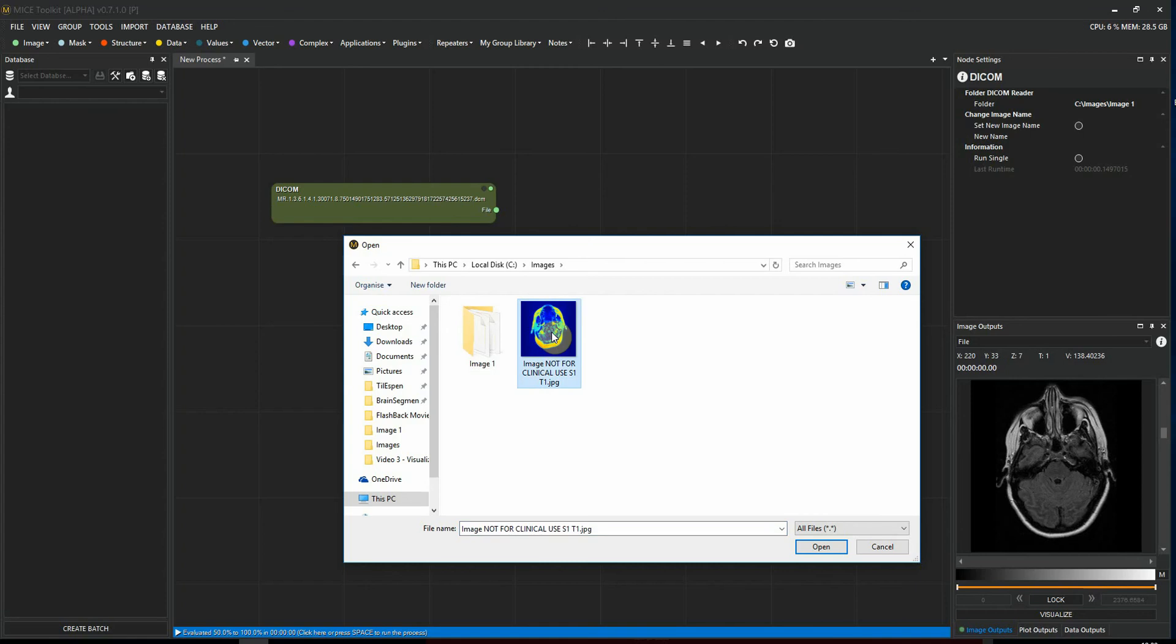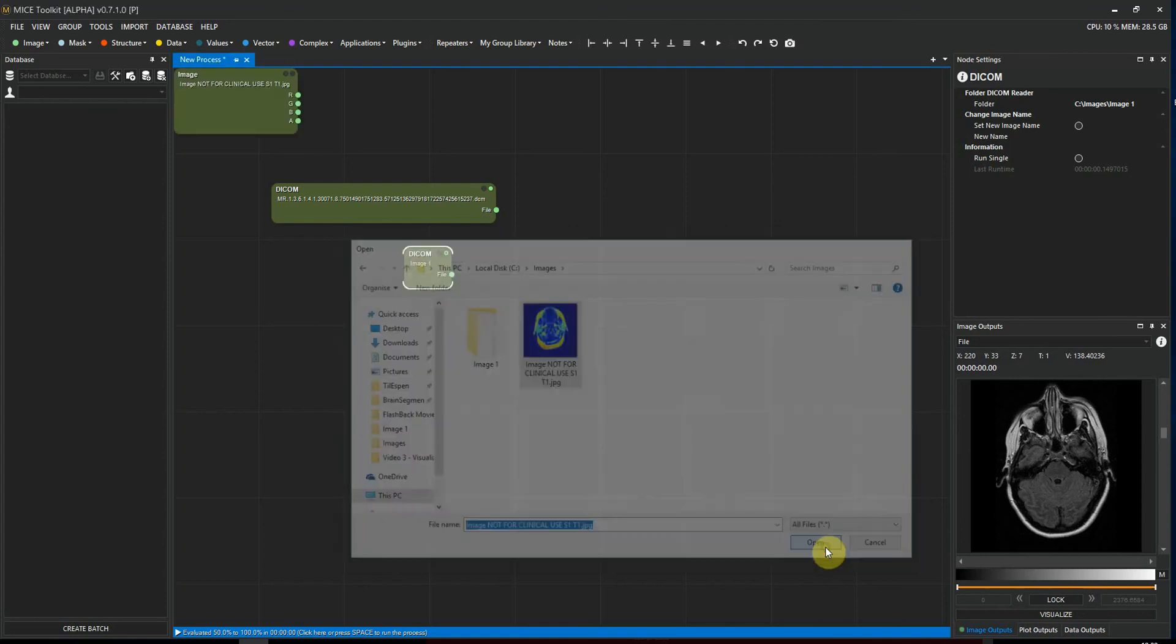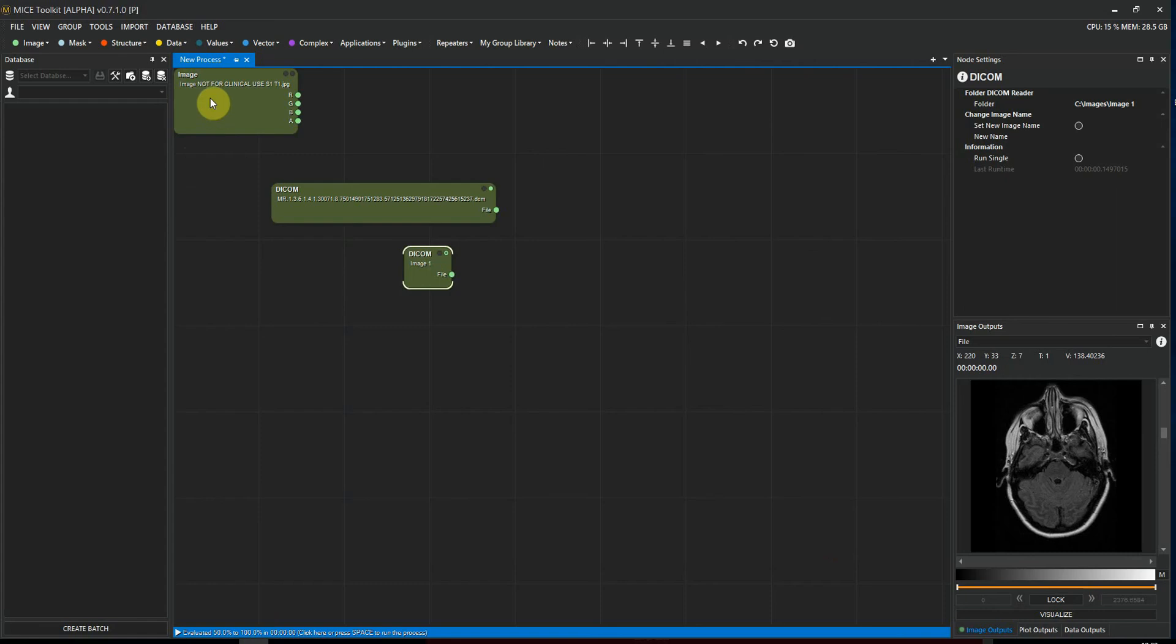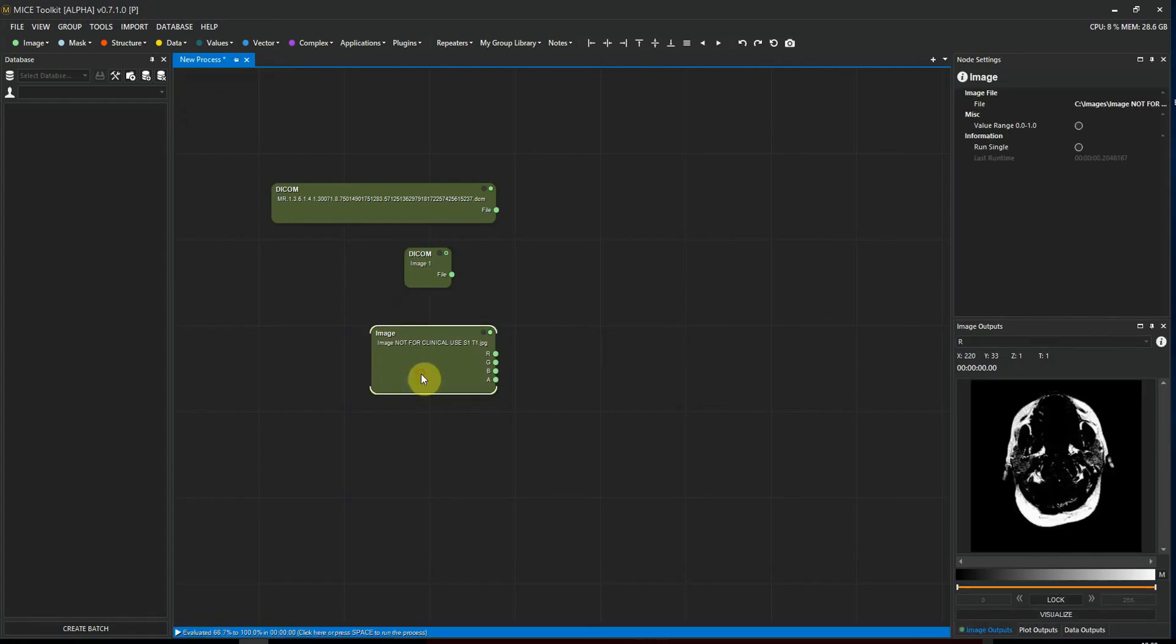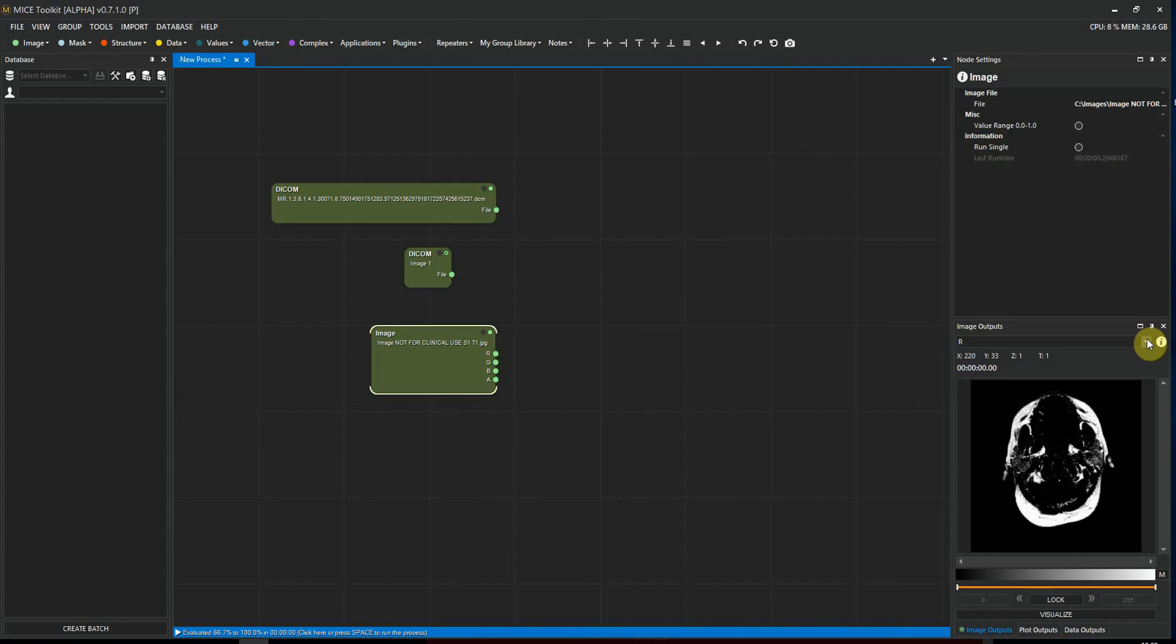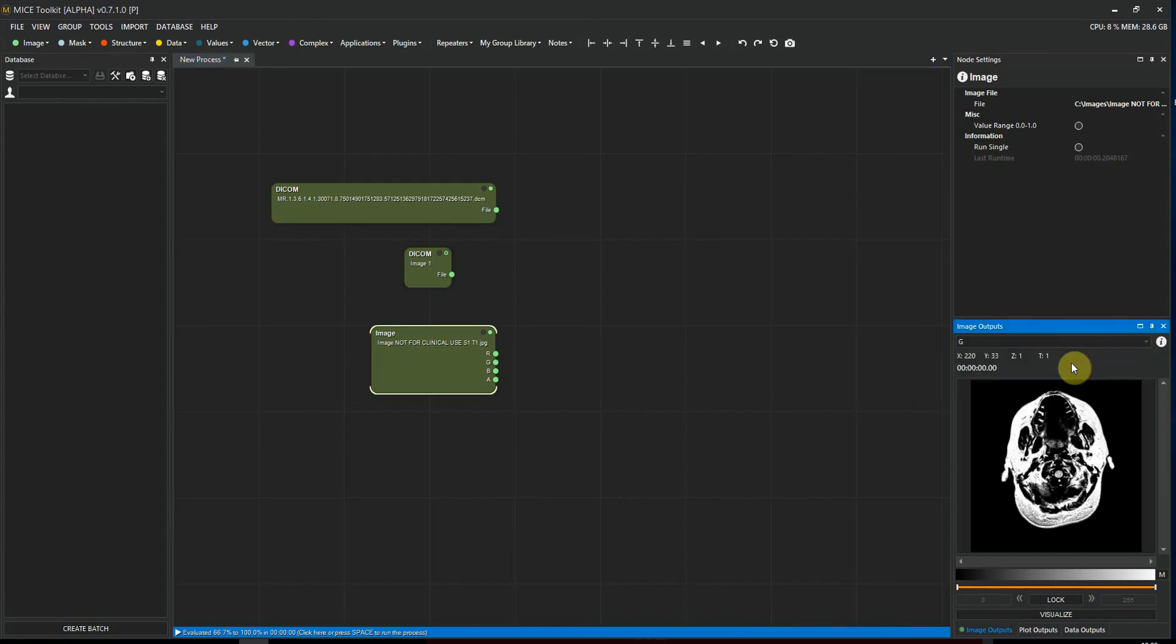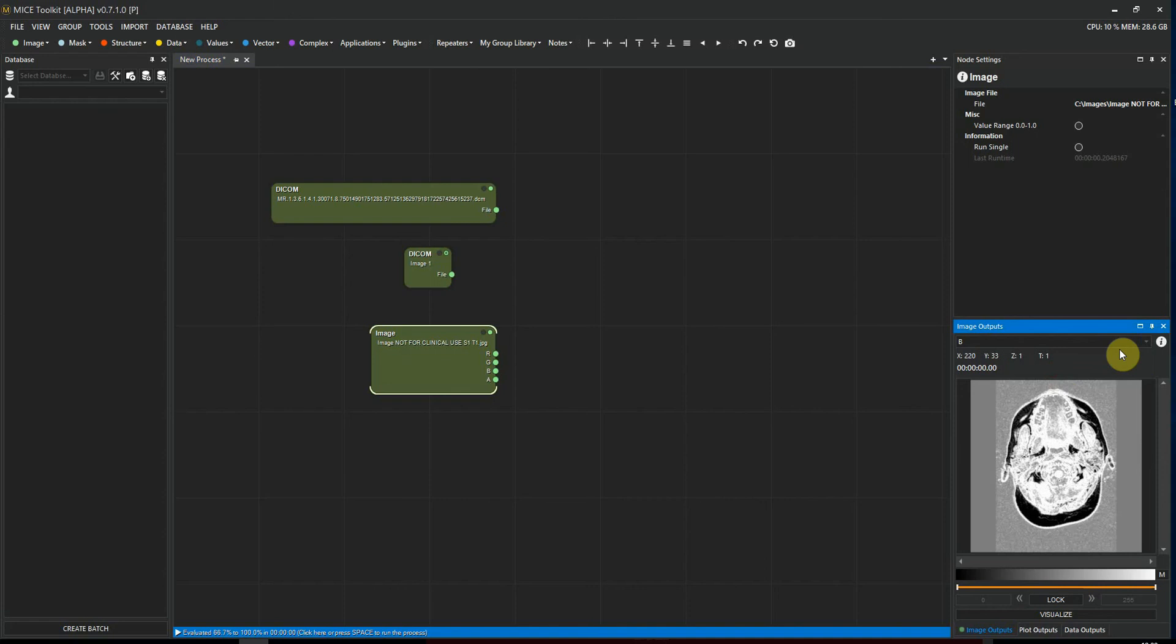I press spacebar to execute, and then we see that this node actually has four outputs. It has one output for each channel, so we have a red channel, green, blue, and an alpha channel. So if we go to the image output here, we see that the red channel is selected. You can view the green channel or the blue channel. The alpha channel is actually uniform here, so it will show us basically nothing.